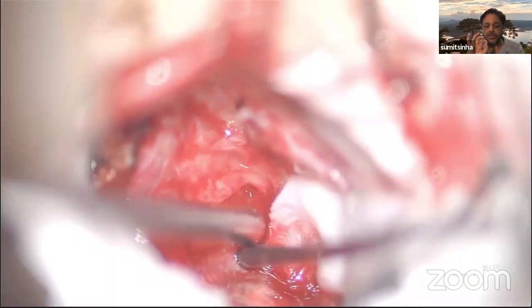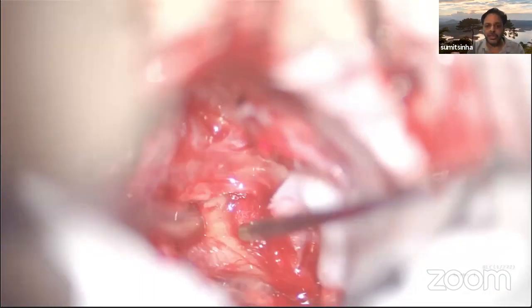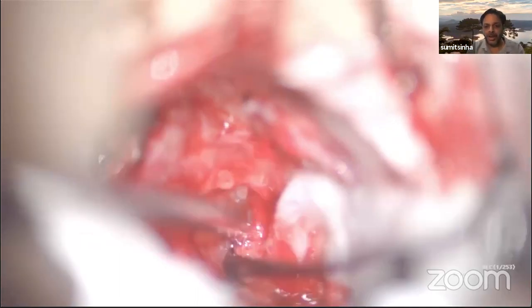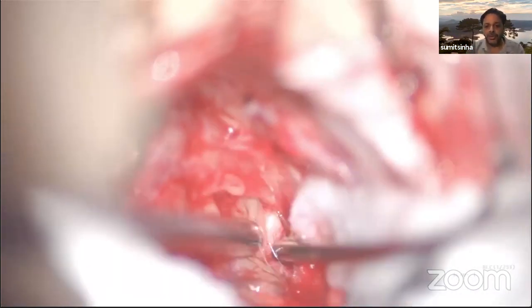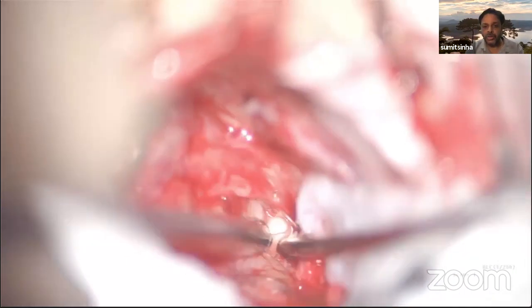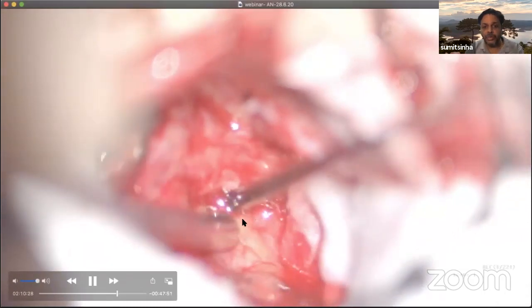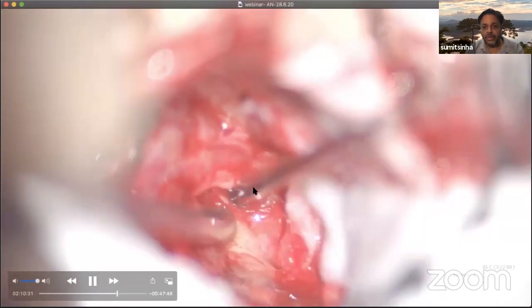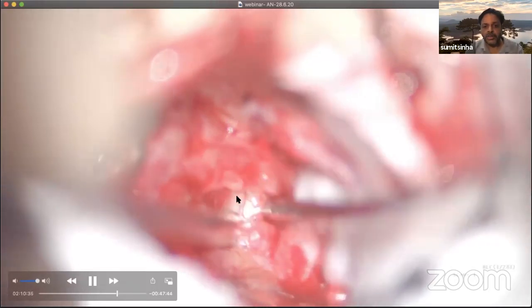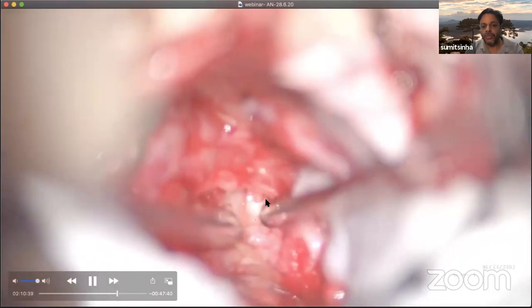This is so sensitive that if you keep your cotton patty over this facial nerve, it might get damaged with the weight of your patty. So be very, very gentle, very, very delicate with your facial nerve. You see the tumor capsule, no arachnoid between the facial nerve and the tumor capsule. It cannot be as clear as this. Can you see that? This is the facial nerve, this is the tumor capsule. We don't find any arachnoid plane over there. All the arachnoid is outside the facial nerve over here.